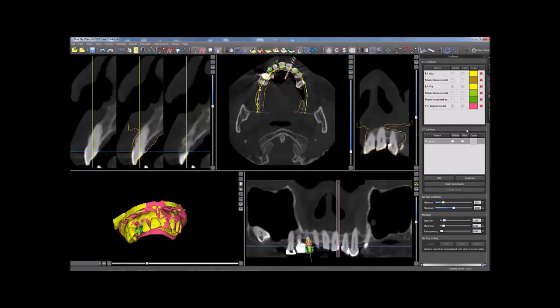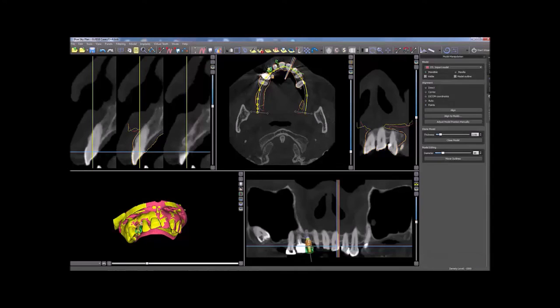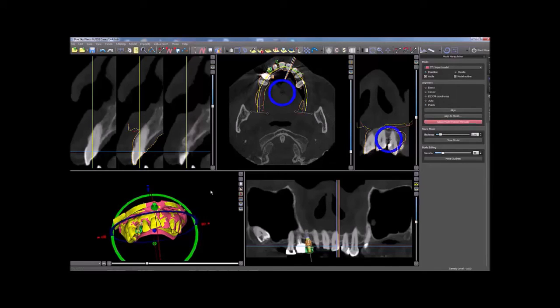Click on the X in order to delete the model from Blue Sky Plan. If necessary, the model can be aligned manually by clicking on the Adjust Model Position Manually button in the model manipulation panel. Using the widgets in the 2D and 3D views, the model can be moved and rotated in order to better align the model to the scan.